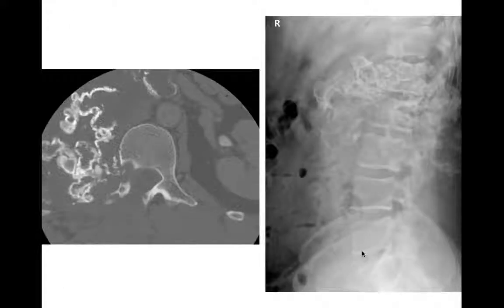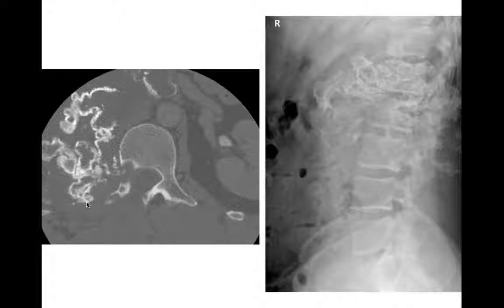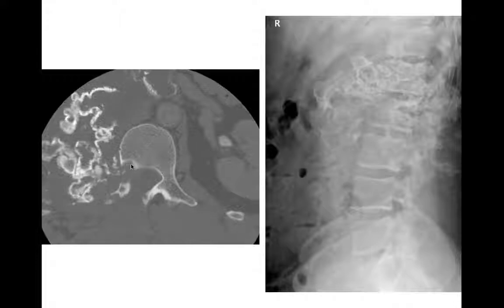Here's a chondrosarcoma occurring off the vertebral body in a patient who also had multiple hereditary exostosis — this one underwent malignant degeneration, starting as an osteochondroma arising from the vertebral body or rib. On the lateral radiograph, there's a massive calcified mass with a large soft tissue component, eroding or involving the vertebral body and rib. This was a chondrosarcoma from malignant degeneration of an osteochondroma.